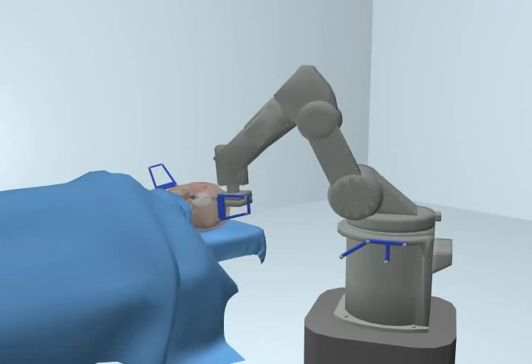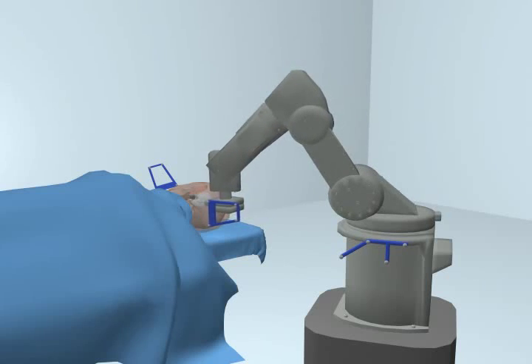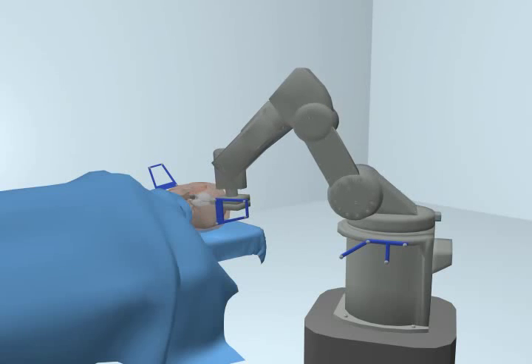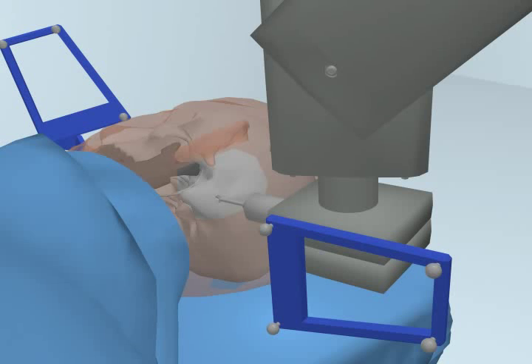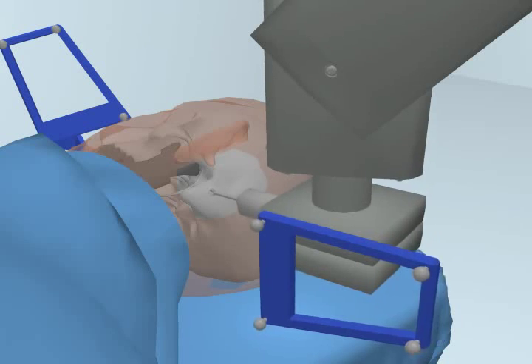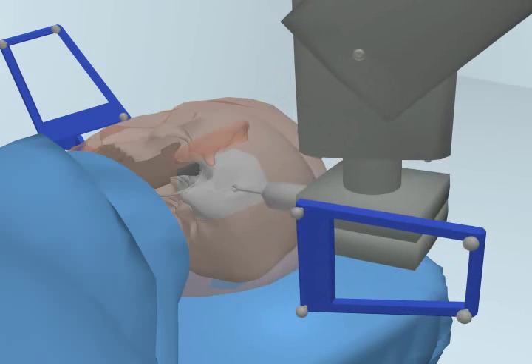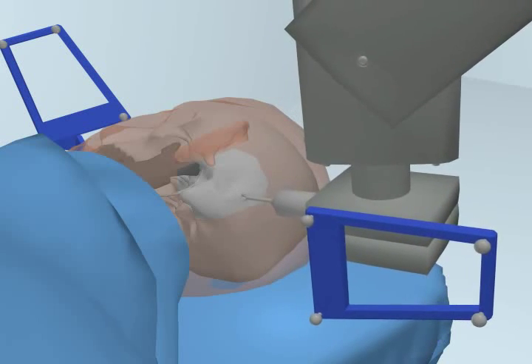The robot then executes the path specified on the CT scan, which is now duplicated on the patient after registration of the CT scan to the patient. Note that when the patient moves, the image tracking system tracks both the patient and the robot and corrects the motion of the robot to achieve the intended trajectory.